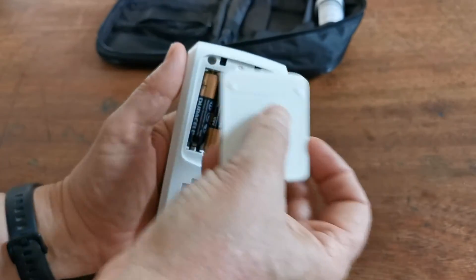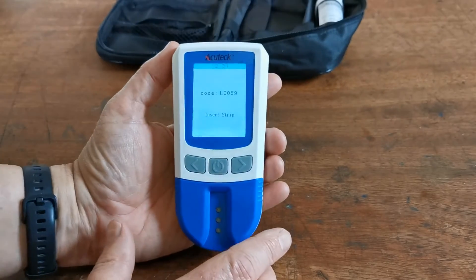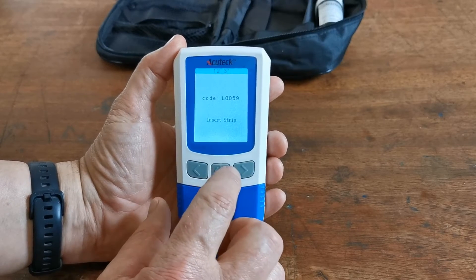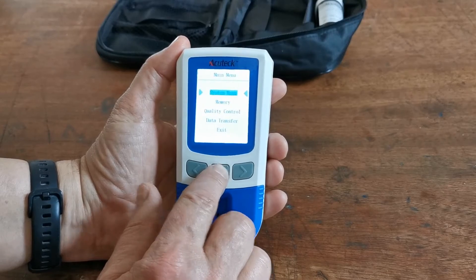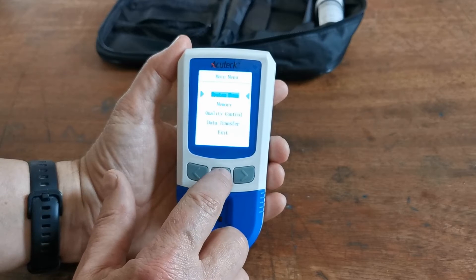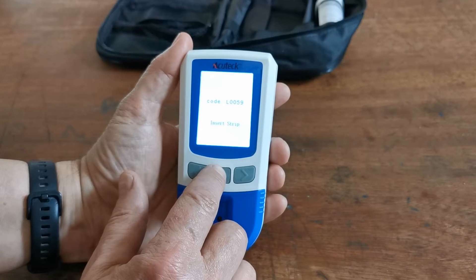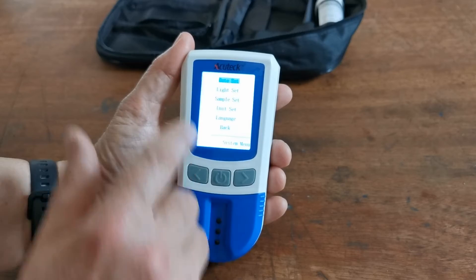Put the battery compartment lid back on. If you want to use the memory and recall function for tests you perform, you need to set the correct time and date. Push and depress the power button — it takes you to a menu choice. Go into the system menu by depressing it again, and the first option that should come up is time and date.